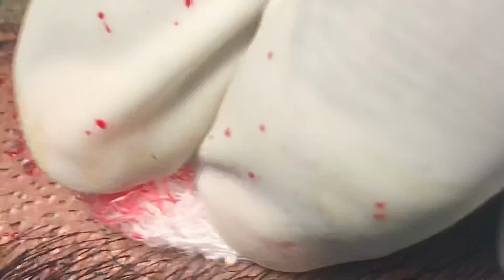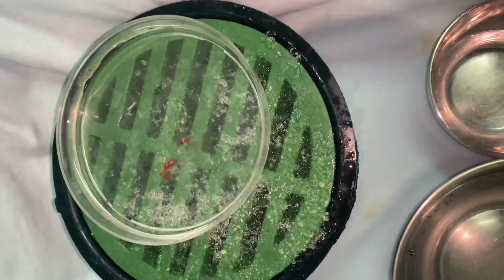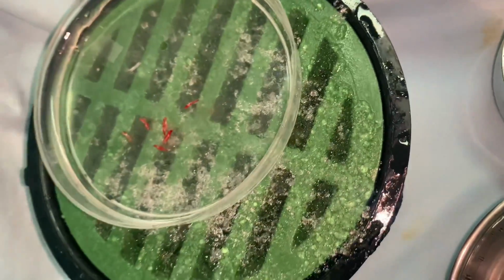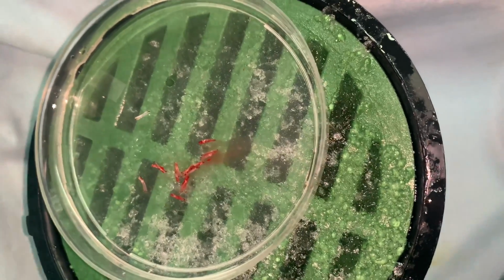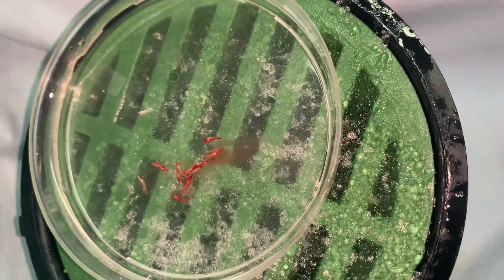You've got to be very precise, separating the follicles, and it's going into this petri dish, and the petri dish is kept on top of a bowl with ice. So you want to make sure the follicles are the right temperature so they last longer before you transplant them.